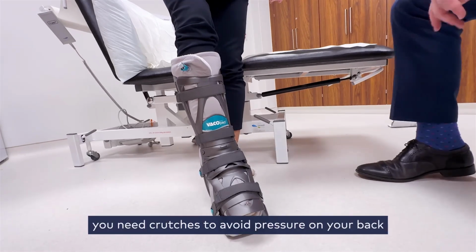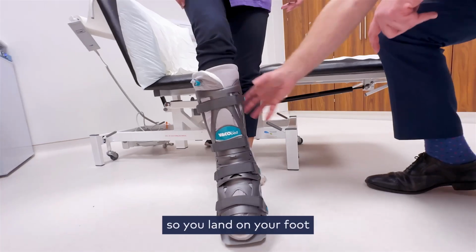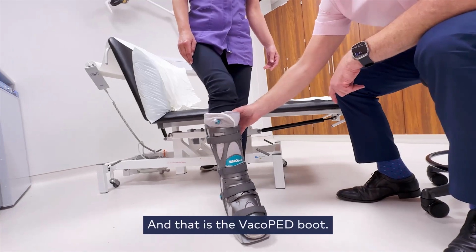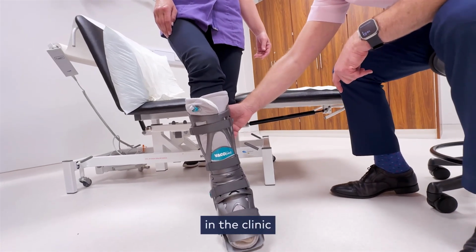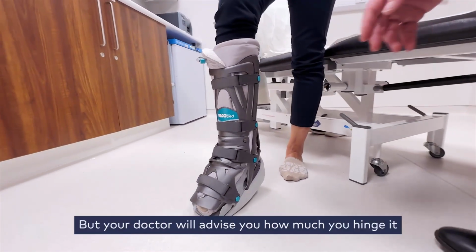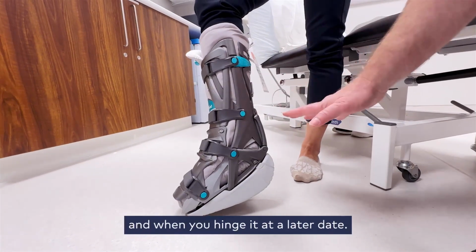Okay, and with this you need crutches to avoid pressure on your back, and your knee must always go forward, so you land on your foot and then as you're coming forward you roll on this. Okay, and that is the VacoPED boot. I'm not going to tell you how you hinge it because your doctor's going to tell you that in the clinic, and you normally hinge it once a week or so until the treatment's ended, but your doctor will advise you how much you hinge it and when you hinge it at a later date.